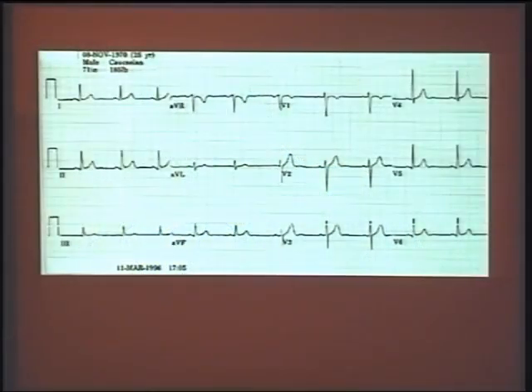2 seconds. Look at the limb leads here. 3 things. Normal axis, degree, 60 degrees. L2 is the positive, isn't it? Tallest positive is L2. 60 degrees. What is the position of the heart? Louder. Intermediate heart. So L2, 60, intermediate heart.